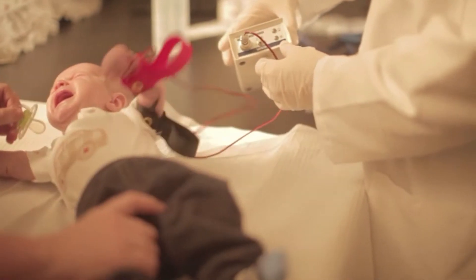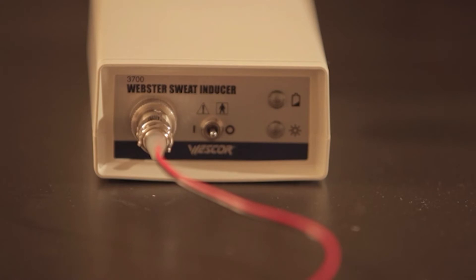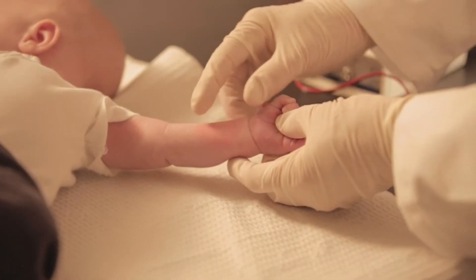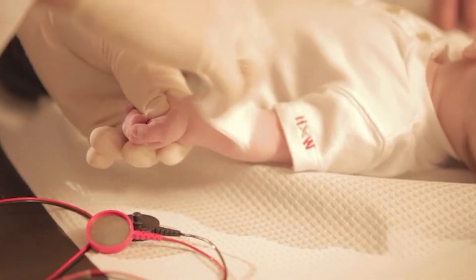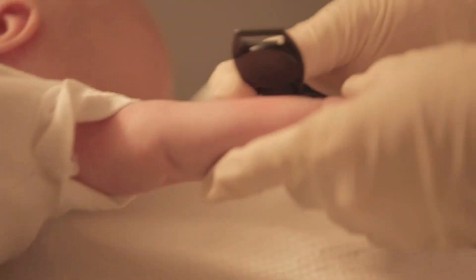The inducer proceeds automatically for approximately five minutes. At completion, an audible tone sounds briefly and the instrument turns itself off. After the inducer turns off, remove both electrodes, making careful note of the exact red electrode position on the limb. There normally is a distinct redness under both electrodes. Clean the stimulated skin and surrounding area thoroughly with deionized water and blot dry. Proceed to the next step immediately.